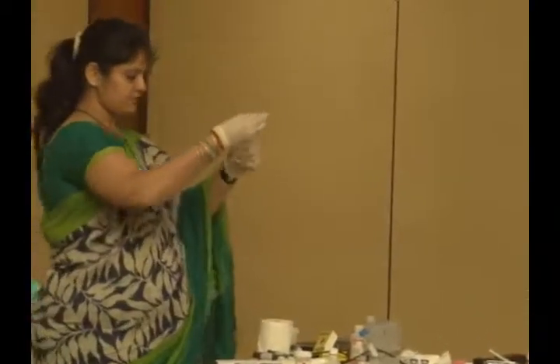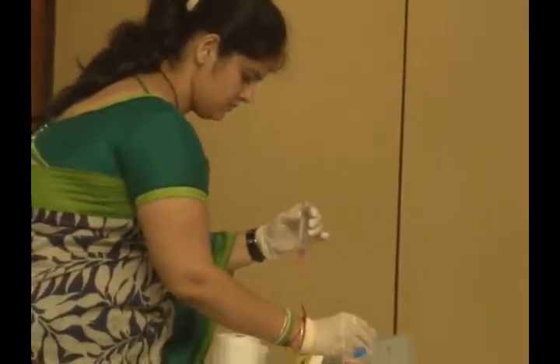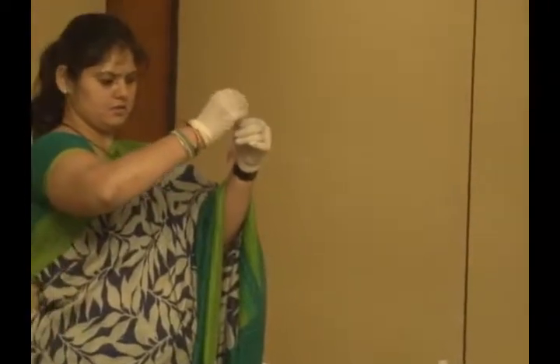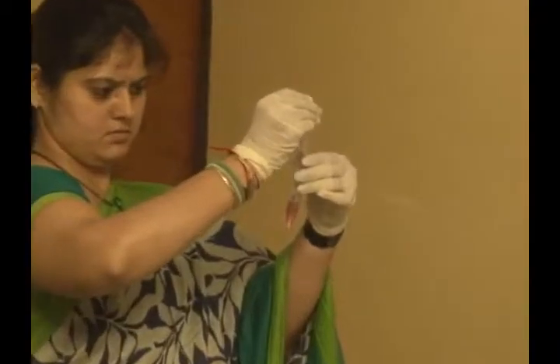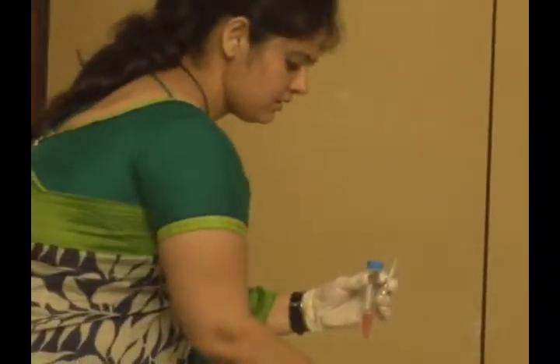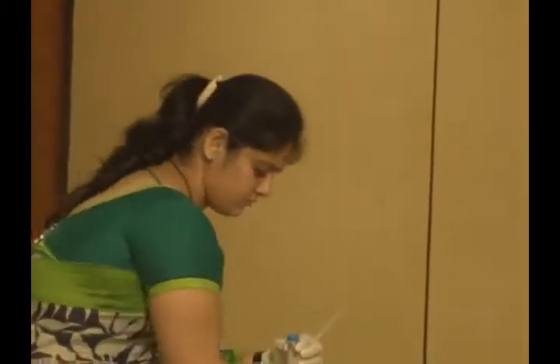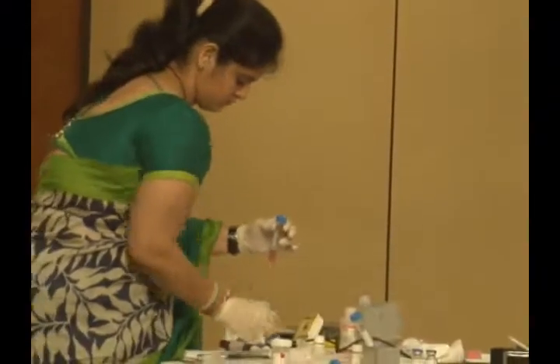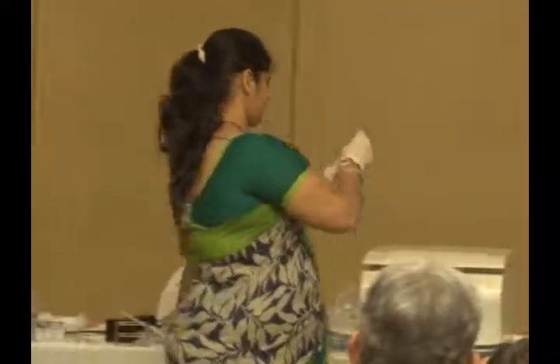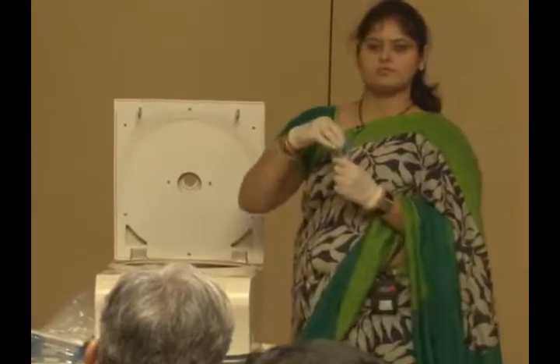Add 4 ml of this sperm wash medium. Mix it properly. And again centrifuge it for 10 minutes at the same RPM, 1500 RPM. In between we will continue with the swim up.